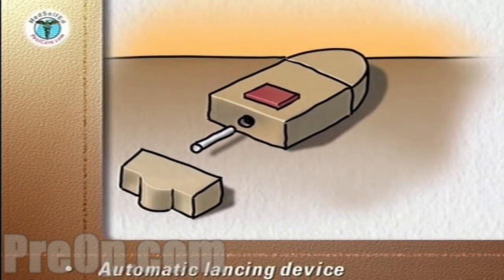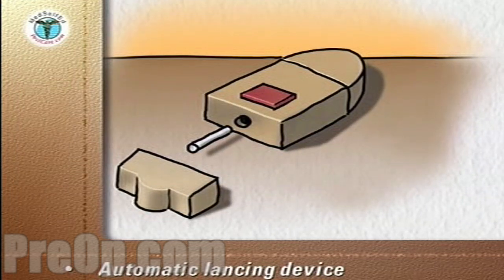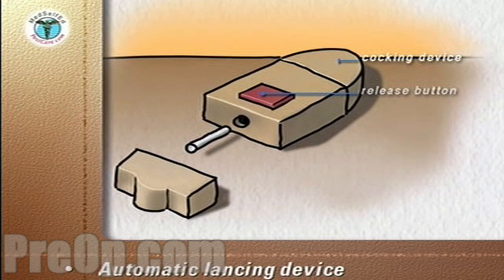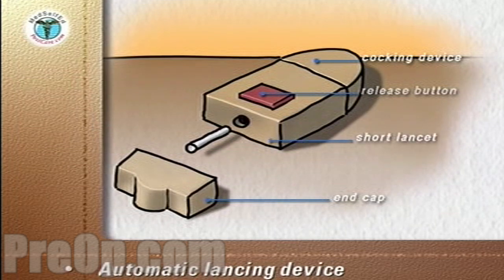The automatic lancing device has three components: the body with the release button, lancet holder, and cocking device; the removable end cap; and a separate short lancet.